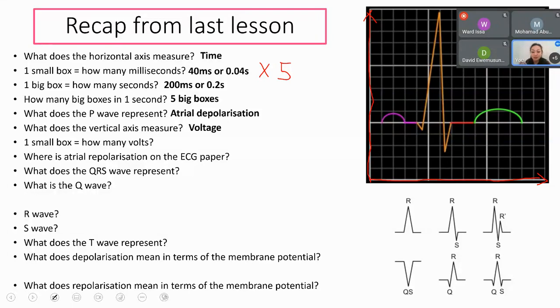So for one small box in this vertical axis, how many volts is that? 0.1 millivolts, yes.